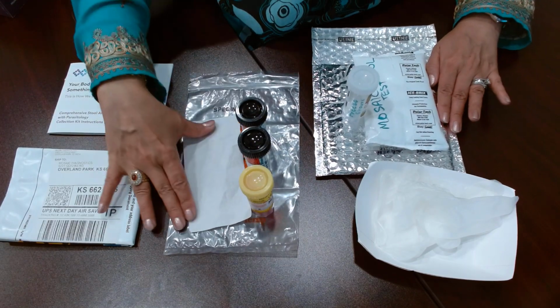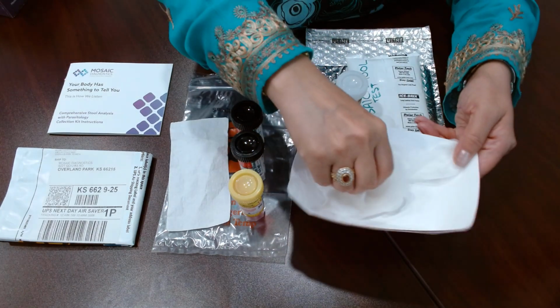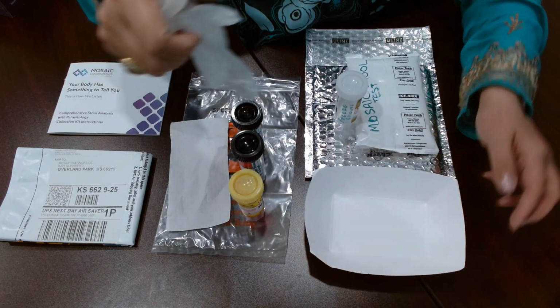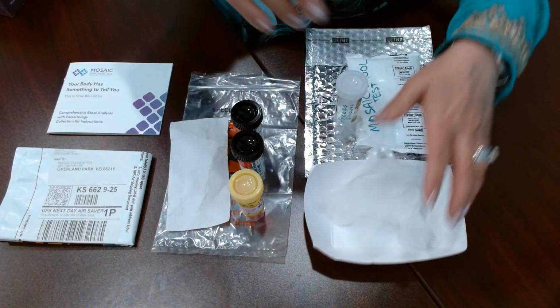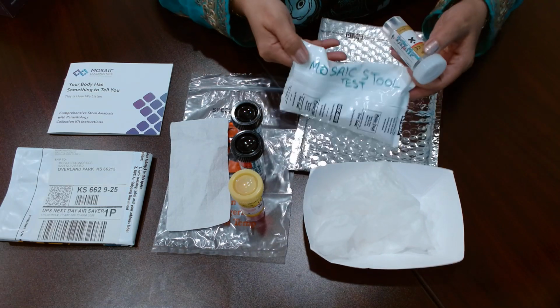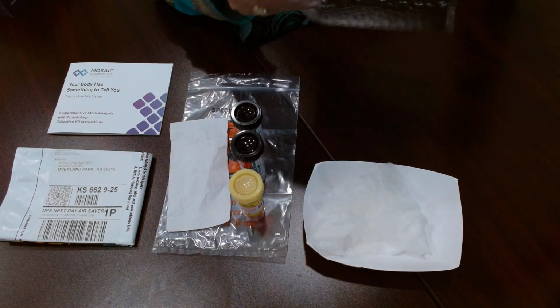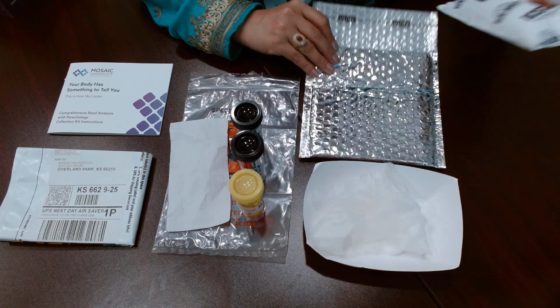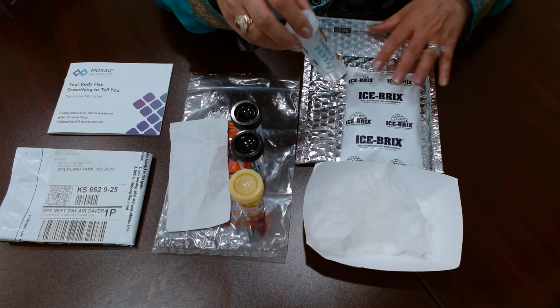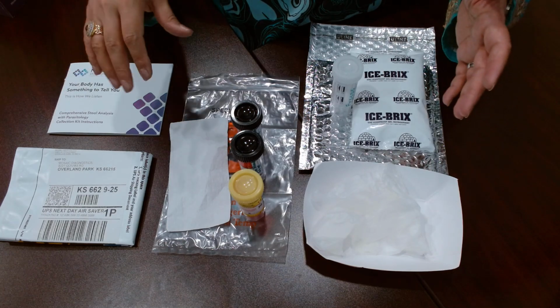This kit has four stool collection vials. It has these gloves, and it has two collection trays over here, since it is a two-day collection test. And it has an ice block, which I recommend that you just write on. We write it for the patients so that it can actually go in the freezer. And then this is a little bag in which you'll put the ice block, and you'll also put the actual vial that goes into the freezer.